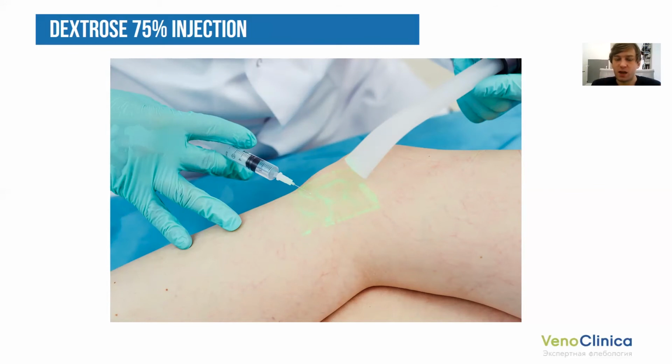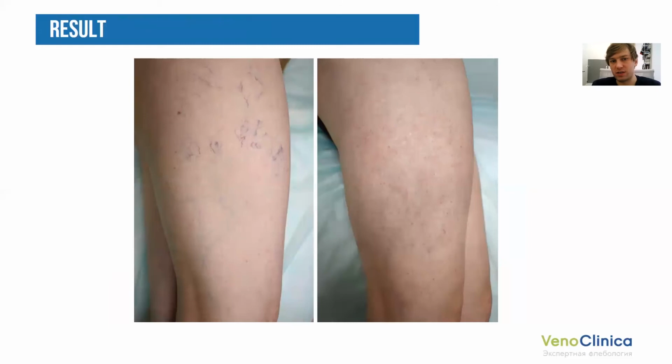Very easy, and you can have very good results after just 2 to 3 sessions of CLaCS. When we started, we thought that after 1 session you would have a good result every time, but it's not true. In the majority of cases, we do 2 sessions of CLaCS, but some patients want to have better results, and we can do a 3rd session.